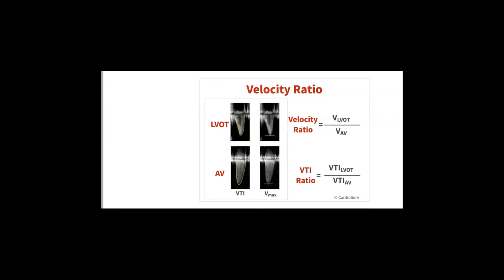Okay? This equation lets you get away with the diameter calculation, and it also has another important value, which is what? It lets you get away with flow, with flow problems. Yes, the doctor said it lets you get away with the diameter. Second, it lets you get away with the flow, because the flow in the aortic valve is a big deal.